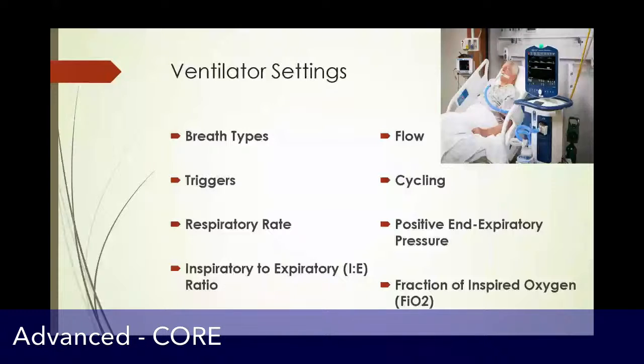Positive end-expiratory pressure, so that's the pressure during exhalation that you maintain to hold open the lungs and the alveoli to allow gas exchange. And then finally the fraction of inspired oxygen. So that's, of the gas that you're putting in the lungs, what percentage of that is oxygen.